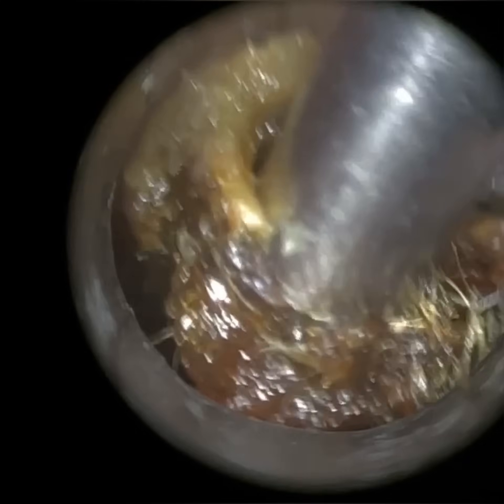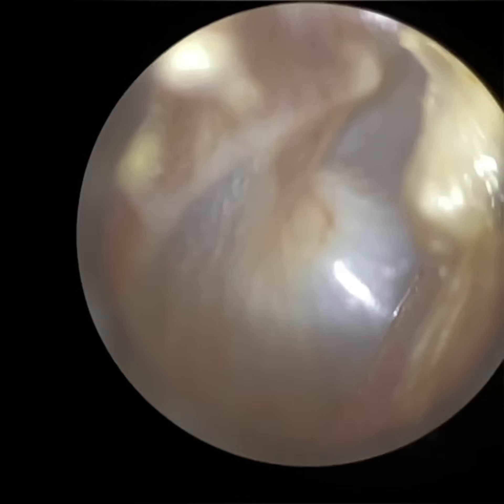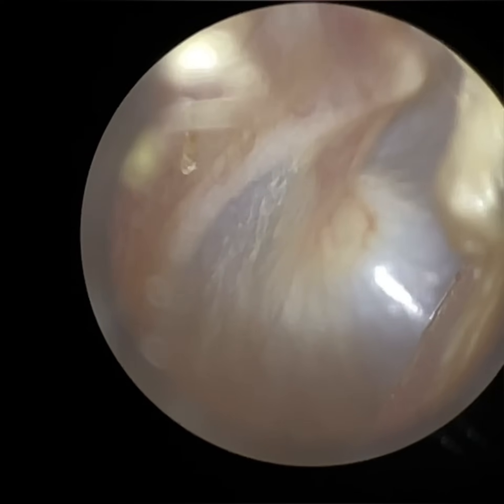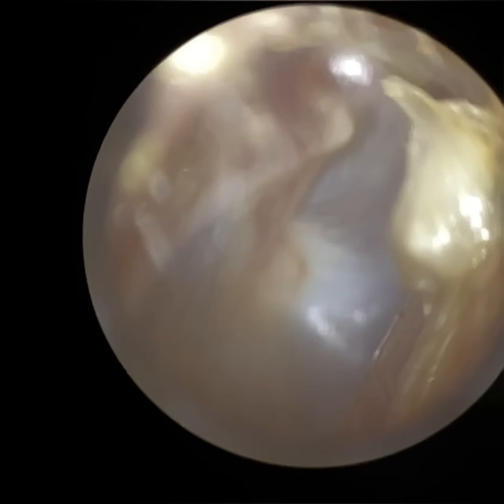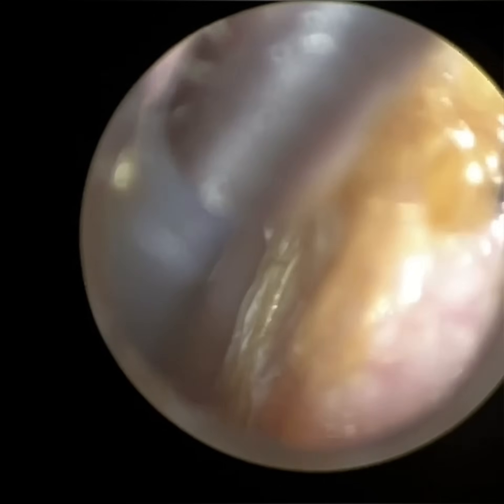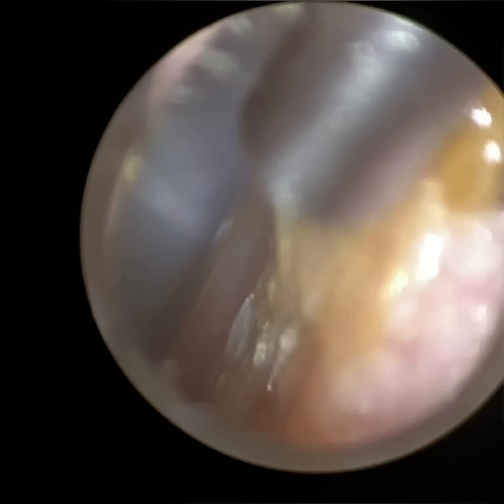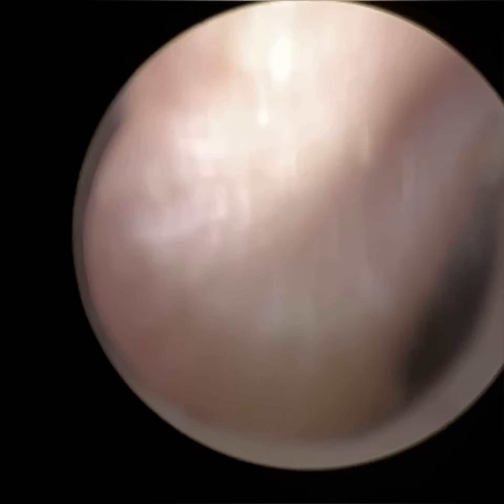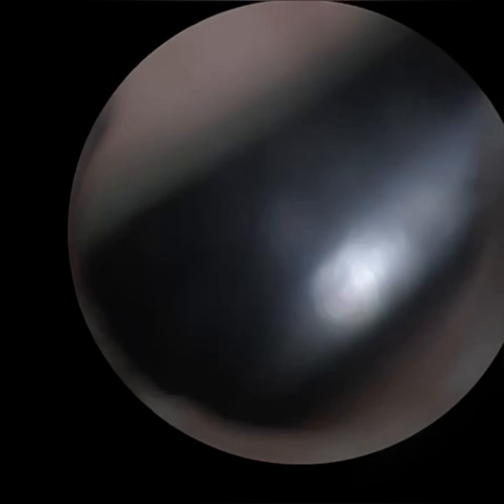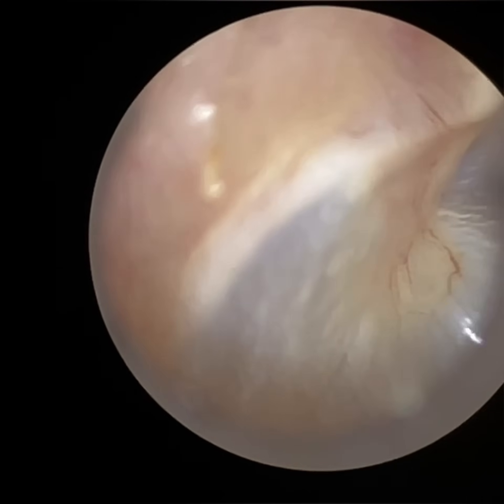We have got a smaller speculum size — 3.5mm internal diameter — and two larger ones than the 4.25, which is what I'm using at the moment. That's a 5mm and a 5.75. Just visualising the eardrum there, getting it in focus. And as you can see with the WAXscope, we can use all ENT micro instruments. We are also launching our own Clearwax range of instruments, which will be more compatible with using the WAXscope, but it can also be used with any other mode of visualisation, if you're already using a microscope or an endoscope, for example.